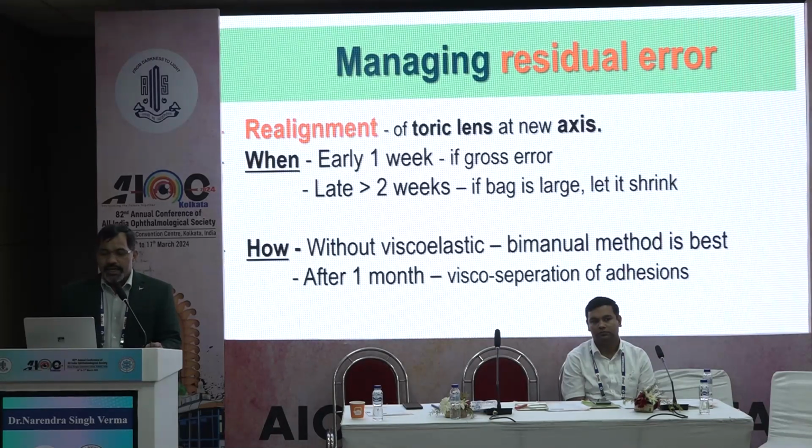Waiting more than 2 weeks is advisable in high myopes, where the bag is very large and if you realign, the lens can rotate. So let the bag shrink a little, then after 2 weeks it is advisable to realign the lens.